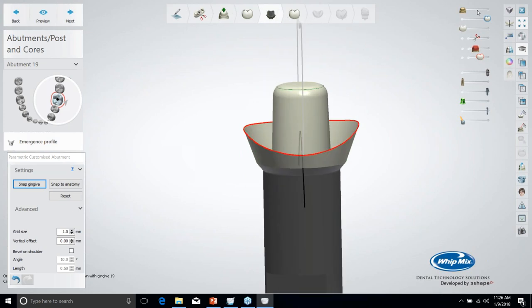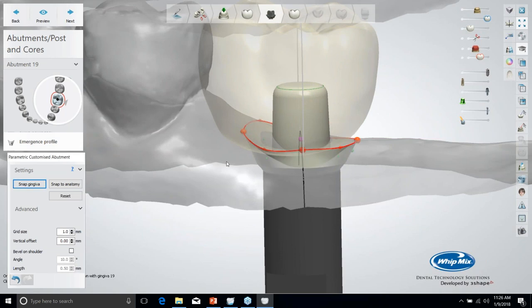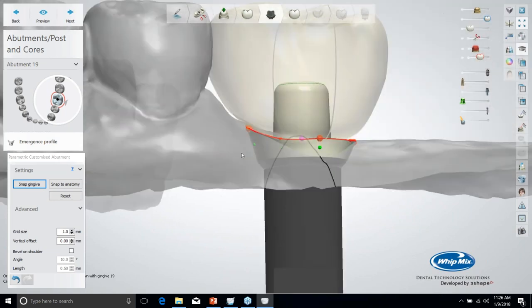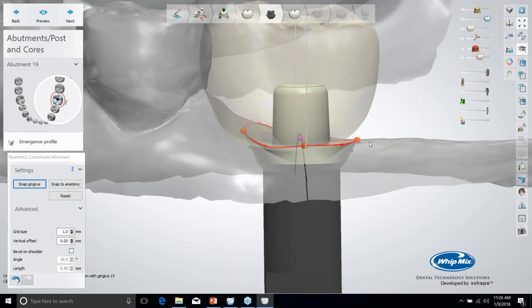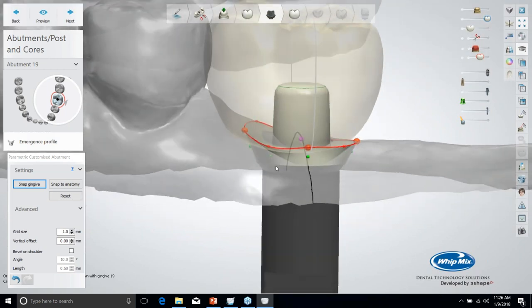There are a couple of options to automatically position this tissue. The first one over here under settings on the left is snap to gingiva. If I hit that button, it's going to try and snap that line to the closest tissue point that it can snap to. Also, on a model that has been poured with an impression coping, you will be able to scan the contour of the tissue down to that analog. Because this scan came out of implant planning software and the implant's not placed, there is no tissue contour.